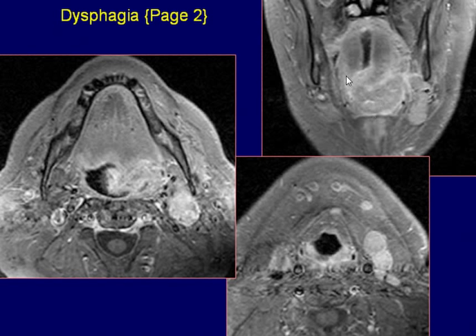Coronal post-gadolinium fat-saturated image reveals extension of the mass superiorly along the lateral left wall of the oropharynx. The mass is also extending inferiorly through the mylohyoid space and into the left submandibular space.